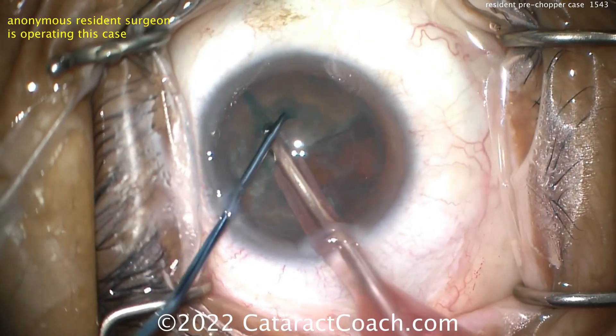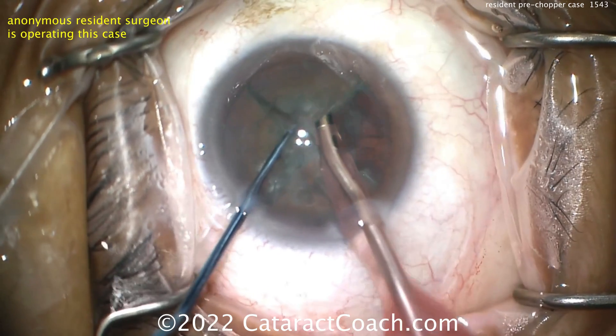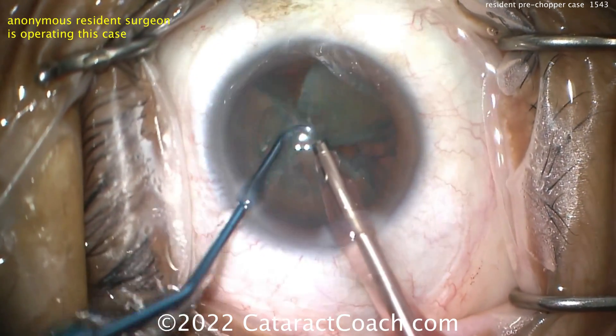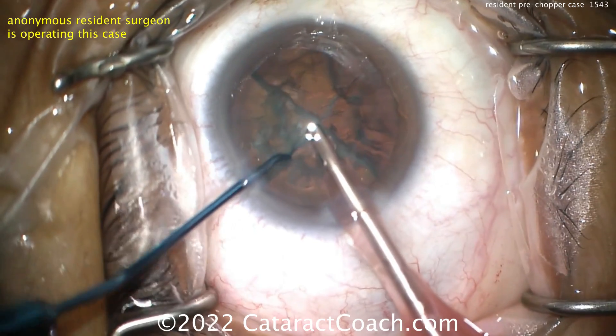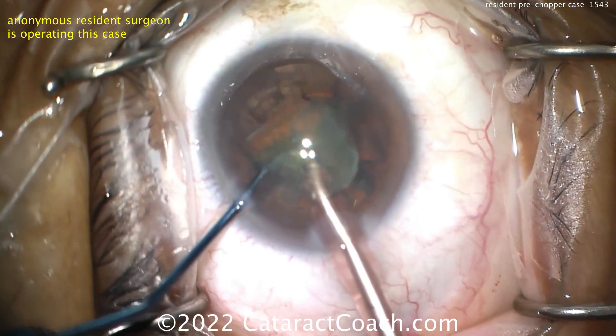Use any nucleofractis technique you like — divide and conquer, stop-and-chop, any variation, quick chop, flip-and-chop, vertical or horizontal chop, pre-chop, or even femtosecond laser if you want to split the nucleus into pieces. Anything you desire is going to be reasonable.